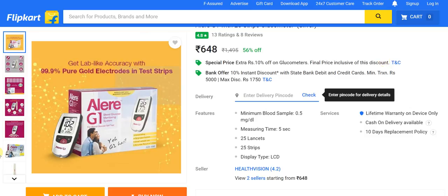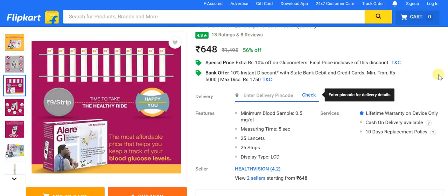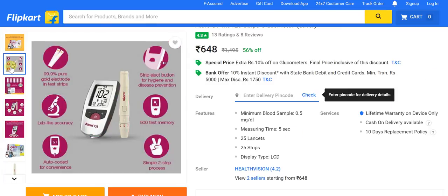The device features 99.9% pure gold electrodes in test strips, providing lab-like accuracy. Everything is auto-coded, making it very convenient, with all required information displayed right up front. A strip eject button ensures hygiene and disease prevention. Memory stores up to 500 different tests. The whole process is very simplistic, bearing in mind that many users are elderly and not very tech savvy — so nothing complicated here.